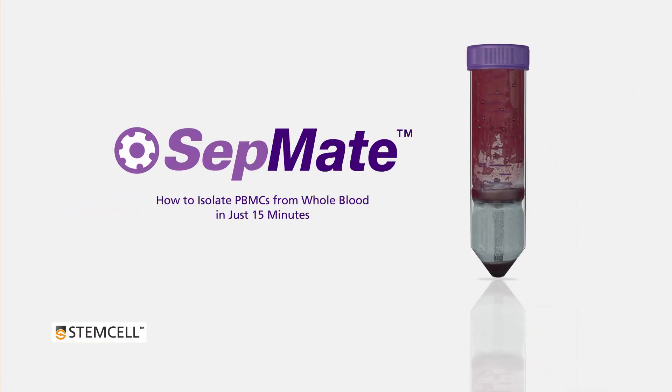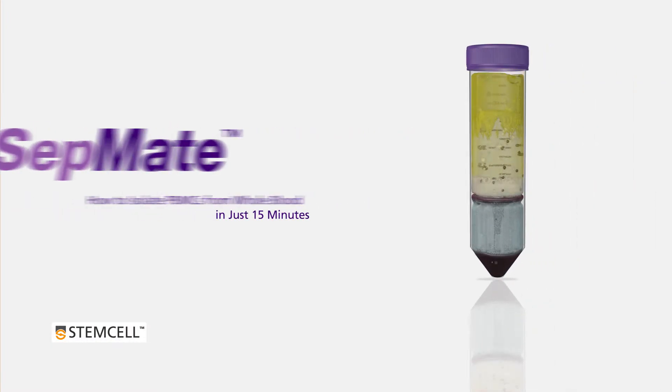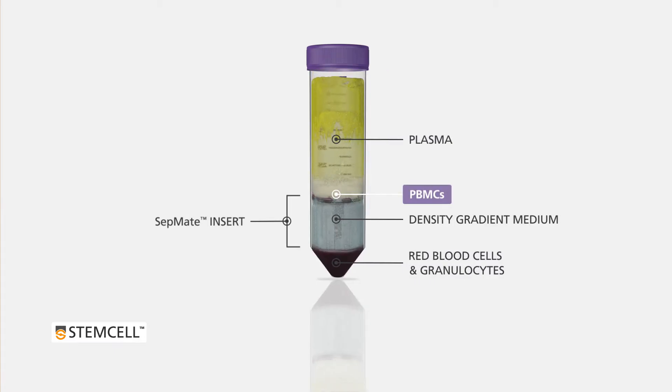In this technical video, we will demonstrate how to use SEPMATE to obtain PBMCs from whole blood in just 15 minutes.